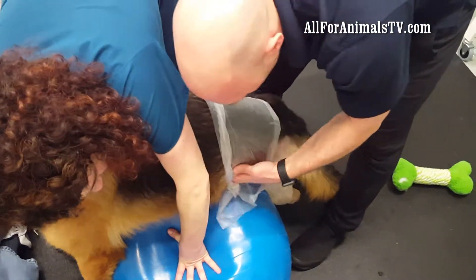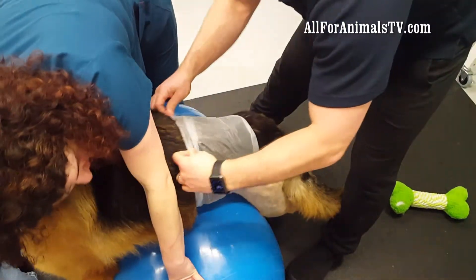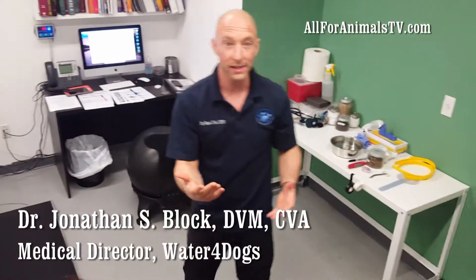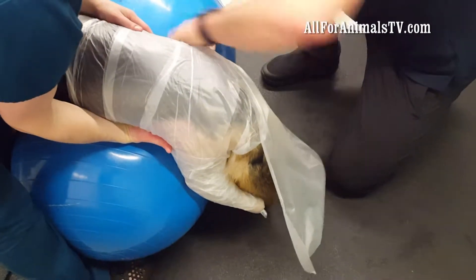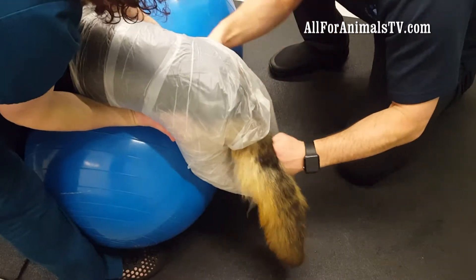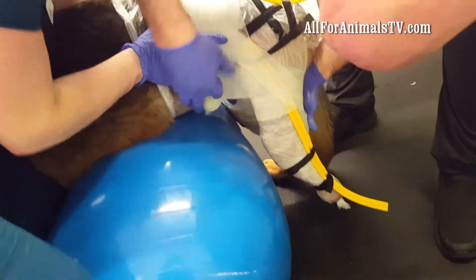We're going to make a fiberglass impression, kind of like what you would relate to a cast for a broken limb in a person. Before we do that, we just have to protect his skin and his coat, so we're putting just a layer — basically saran wrap — between him and the fiberglass impression.